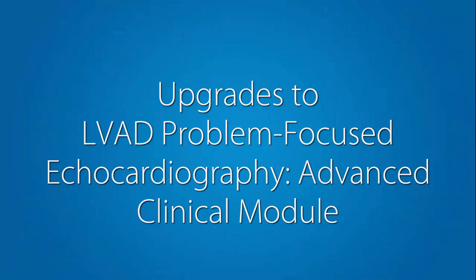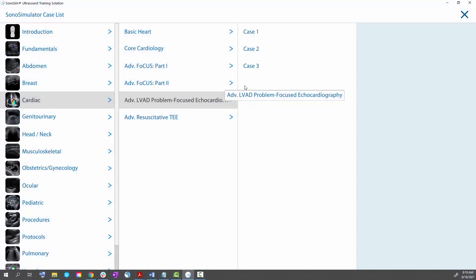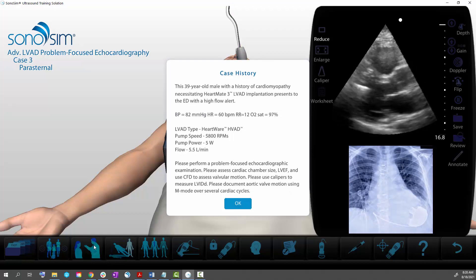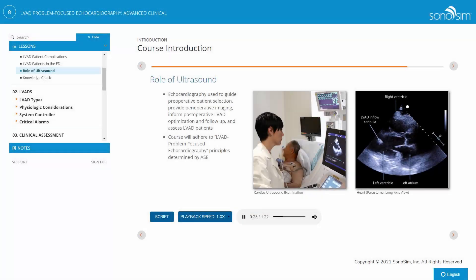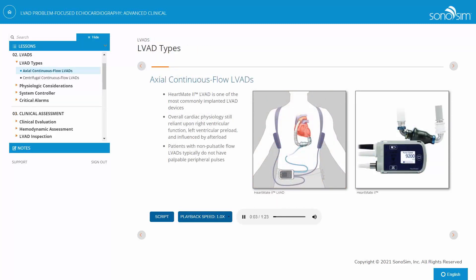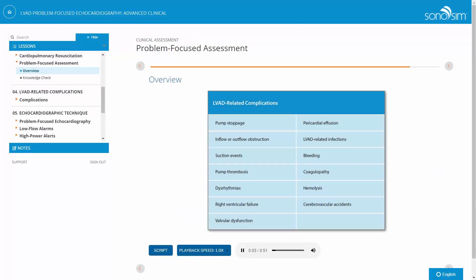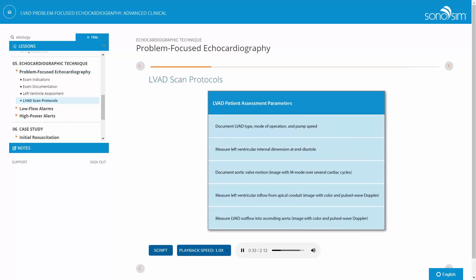In the 3.1.0 Sonosimulator release, we have added two additional real patient pathologies to the LVAD Problem-Focused Echocardiography Advanced Clinical Module. This module provides an in-depth understanding of the role of bedside echocardiography in the evaluation of the LVAD patient with acute clinical decompensation. The course explores mechanics of various LVAD types as well as LVAD complications and how to determine underlying etiology, with a problem-focused echocardiographic technique described for assessing initial evaluation and management.